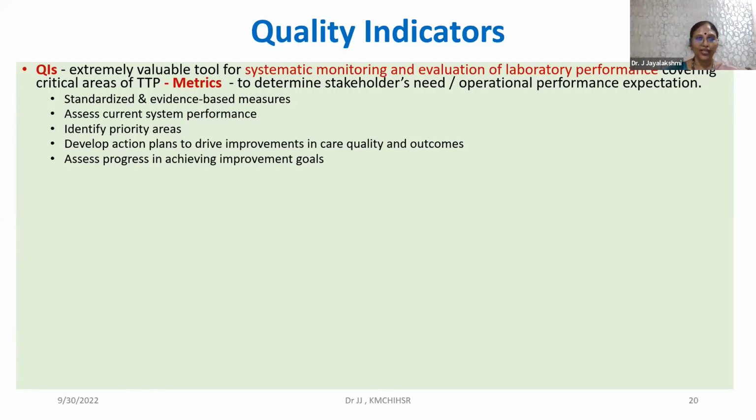So the person who had captured tried to explain, but it is always good that you have a standardized methodology of capturing. So everybody who captures, whether I capture or my colleague captures or the junior most faculty, junior most technical staff assigned to capture, or quality person assigned to capture, captures what needs to be. So this is a very, very simplified capture tool to do that.